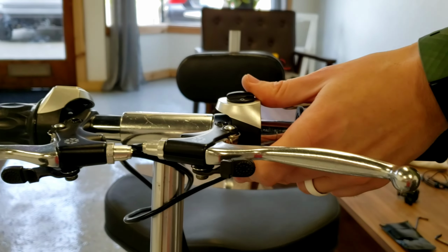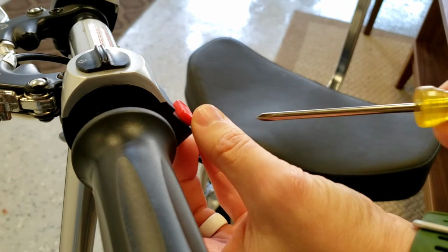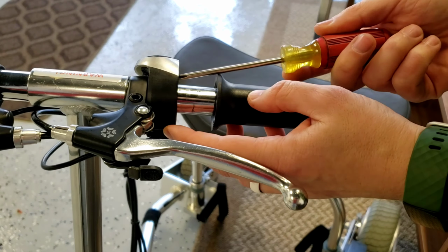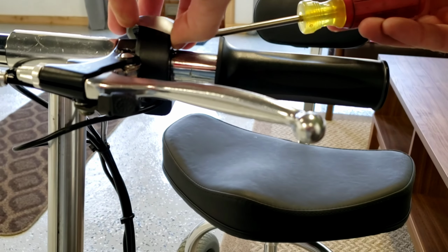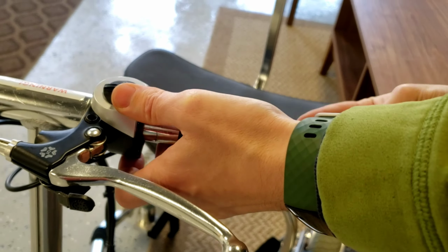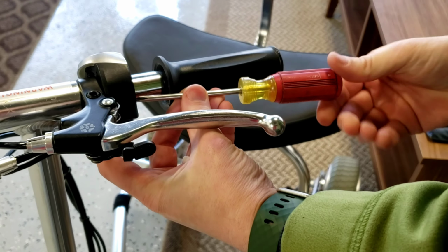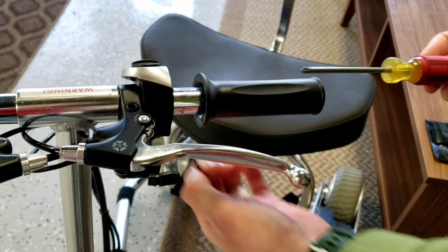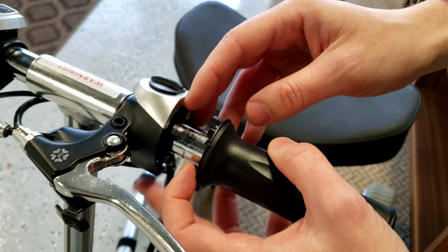From here, we're going to grab our Phillips head, and there are 3 screws on the on-off switch. We're going to undo those. Just make sure you don't lose them. And as long as you have everything loosened up and towards the center, you should have more than enough room to remove all 3 of these. Okay, so now that that is off, we're going to pull out that piece there.